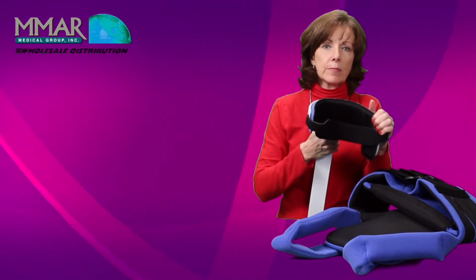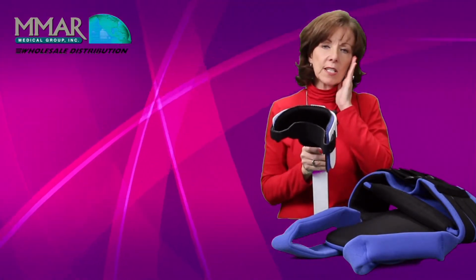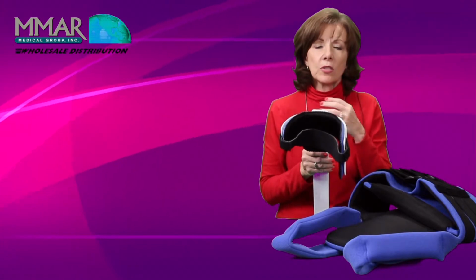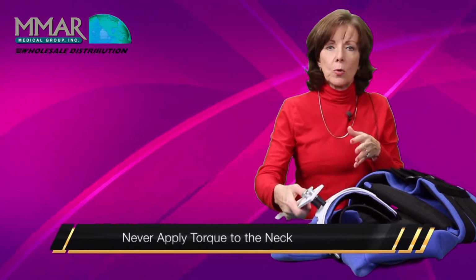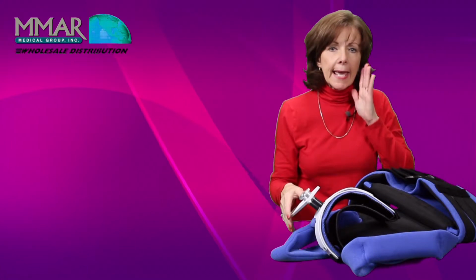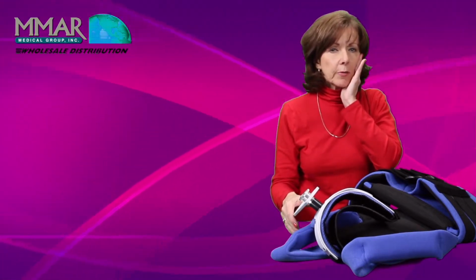This allows them to lean into their tone. Now I've set this straight up. So the patient is still going to the left, but we can range them almost to normal. Never, ever, ever torque a neck. Never. You want to massage their shoulders, make them comfortable, and just have their therapist or their caregiver bring their neck up very gradually.